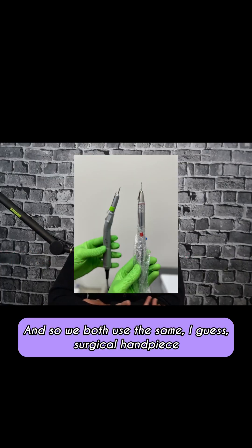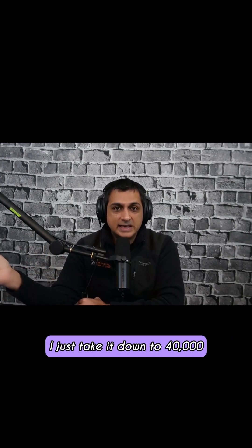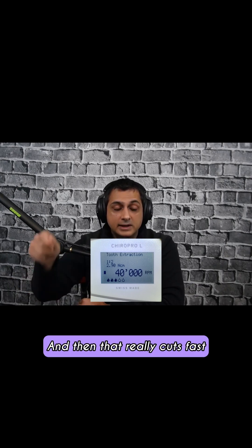We both use the same surgical handpiece. When you have it on the tooth extraction setting, it's at 80,000 RPM, generally at one to two — so it's like 40,000, but then it makes it 80,000 essentially. When I use that coronectomy bur, I just take it down to 40,000. It's less chattery, and then that really cuts fast.